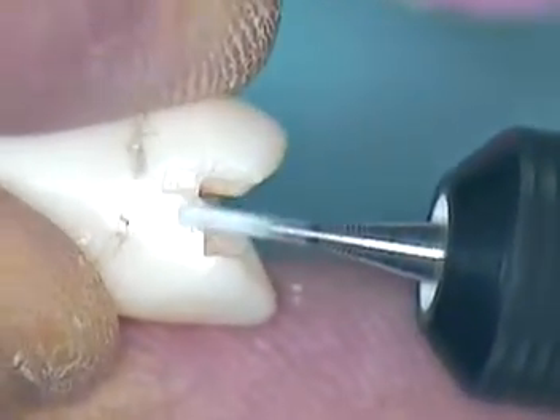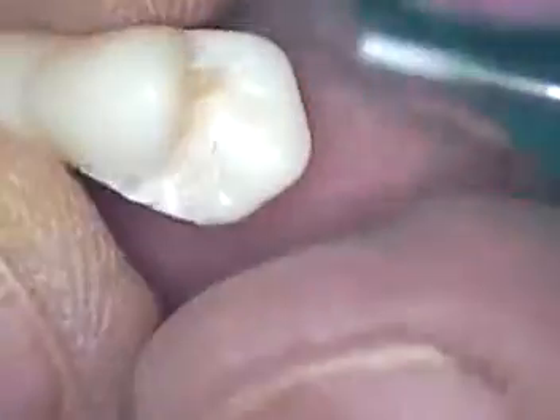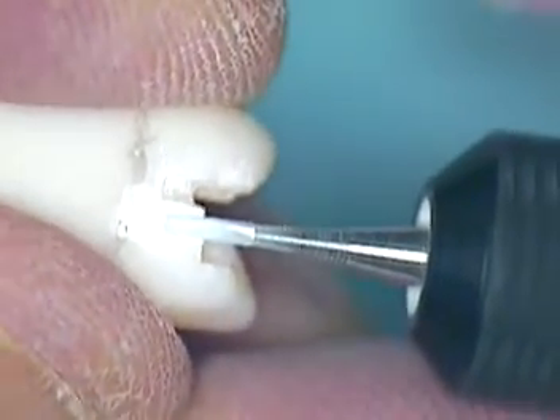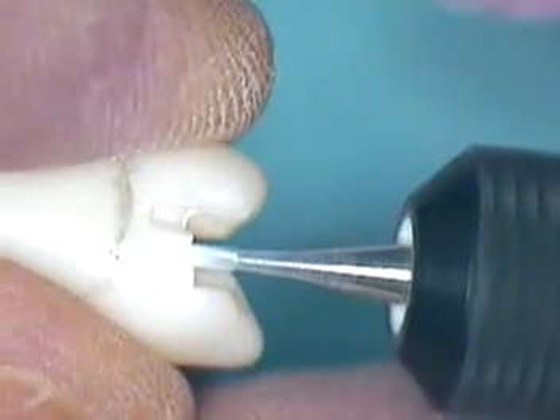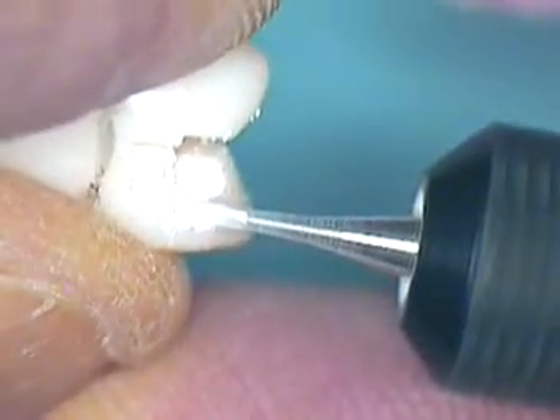There we go. Let's put the next one right there. It's a lot easier to do it this way — you can push straight down through the occlusal, which is okay. So through what we call now the pulpal floor, which is going to turn into the gingival floor. To give you a three-dimensional look at the box preparation — that's almost the right depth. That's a little bit more, that's about it right there. Notice how quickly it cuts vertically.